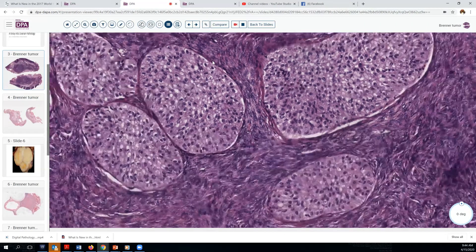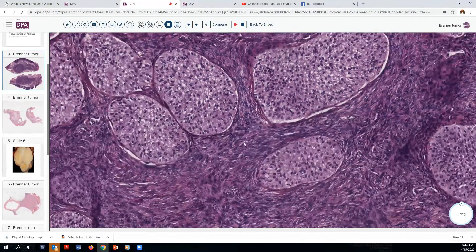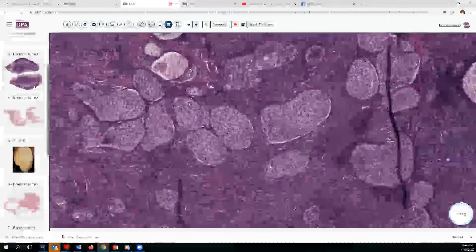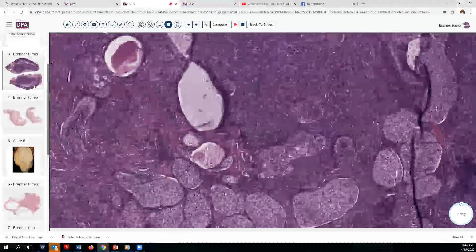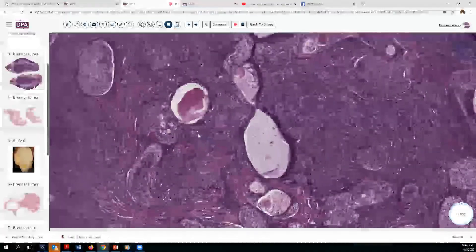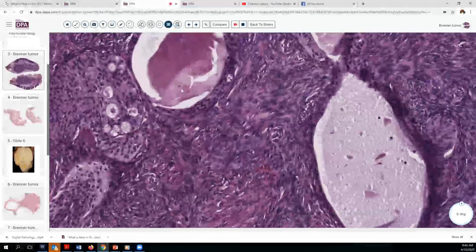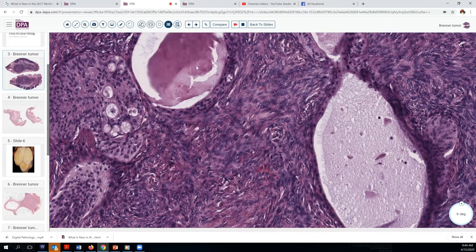Surrounding these nests is a spindle cell fibromatous type stroma. Looking at some of these cystic areas here, for example this one here, we can see that there's some eosinophilic or proteinaceous secretion, and that a few of these areas have a multi-cystic pattern or almost even a cribriform pattern without much atypia.